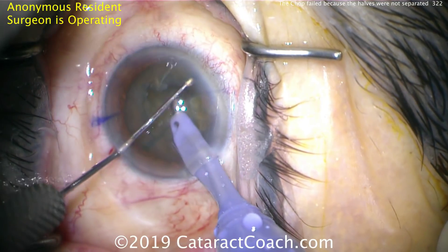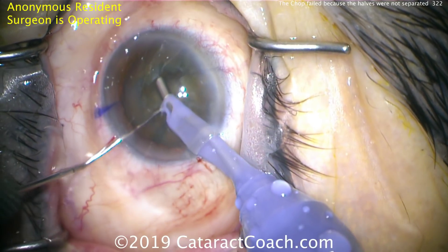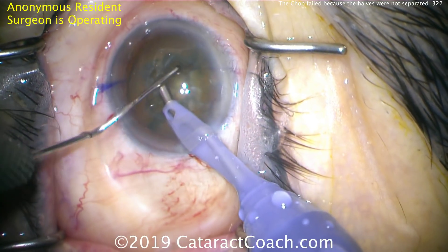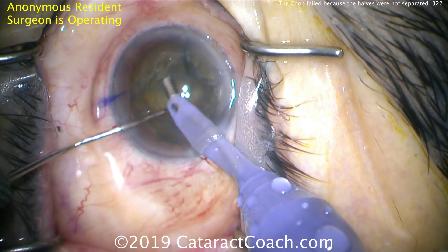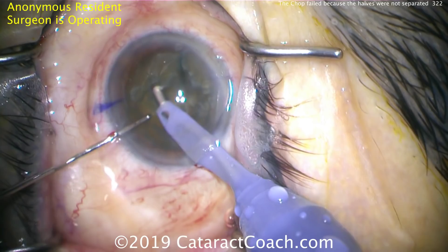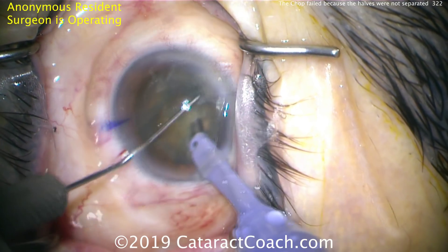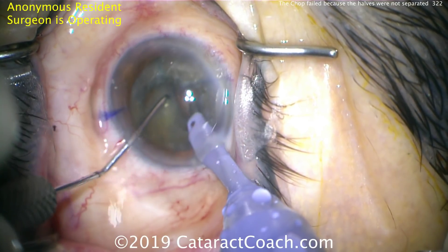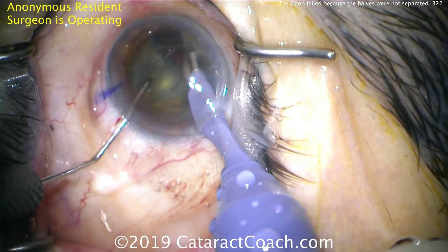Trying again — that looks pretty good, but it's still not sufficient. It must be two complete halves. In order to achieve that, I recommend spreading in the middle of the nucleus, then more nasally, then more temporally at those three positions — we showed this video last week, which I'll link in our description. Trying again to separate the nucleus, it looks pretty good, but there are still some areas of attachment.